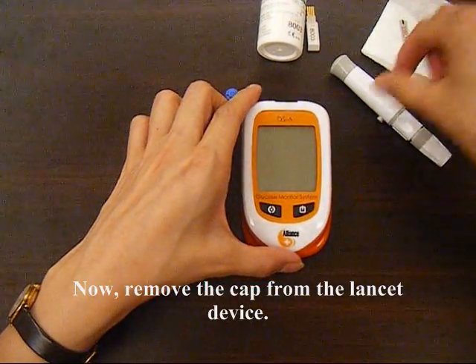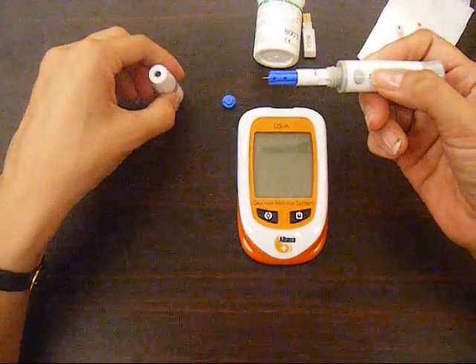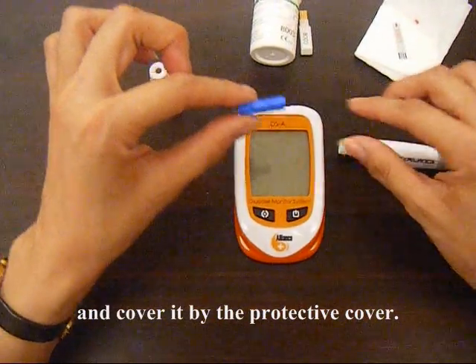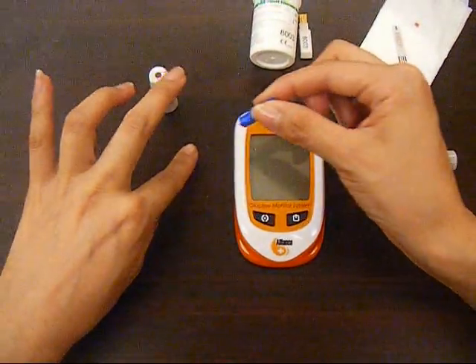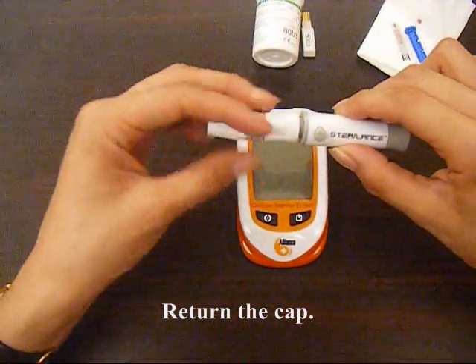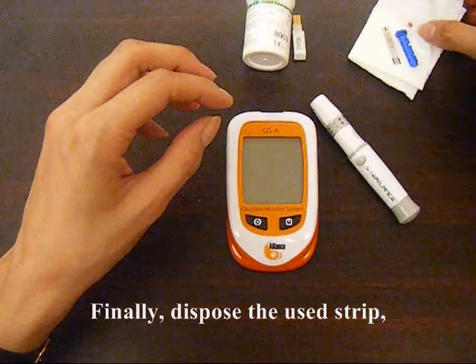Now, remove the cap from the lancer device. Take away the lancer and cover it with the protective cover. Return the cap. Finally, dispose the used strip and tissue and lancer.